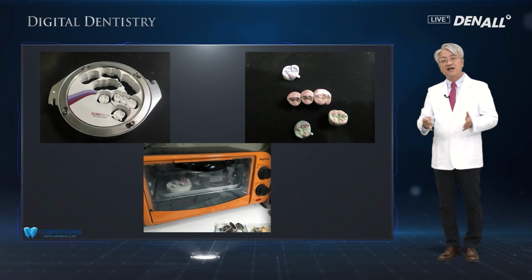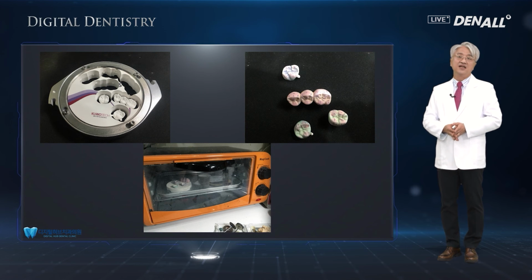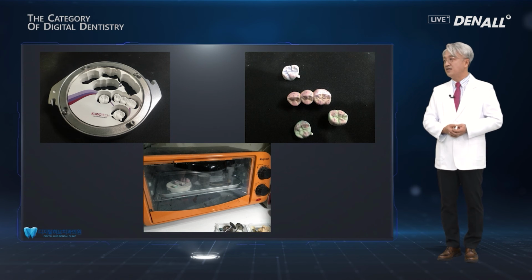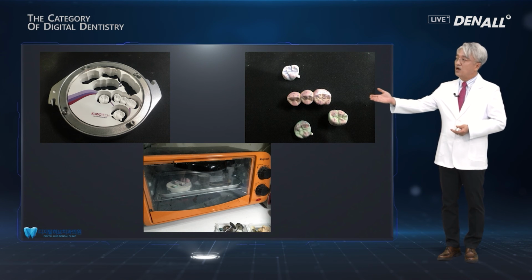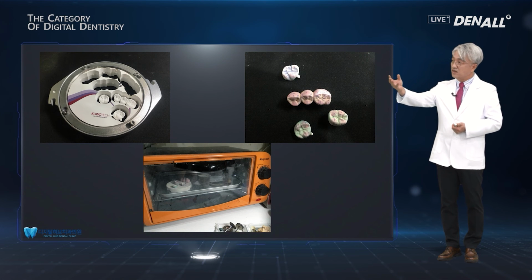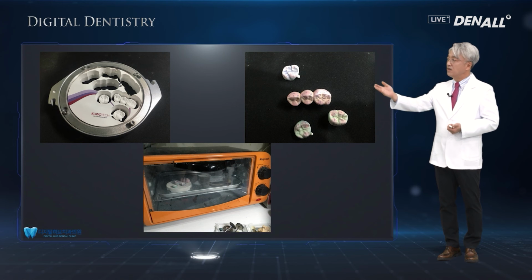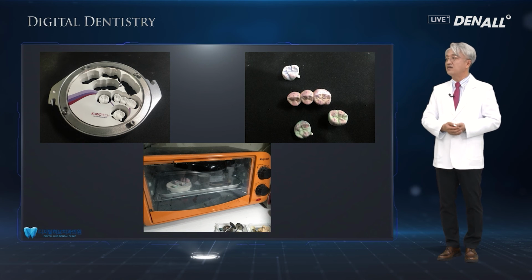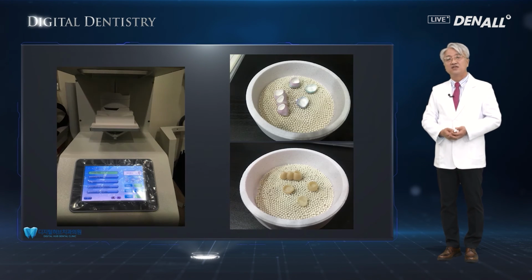And how zirconia is made, let's explain with the color blocks. Like this, using CAD/CAM, a zirconia teeth bridge was made, colored and then sintered, and the final prosthesis will be made. Now on the left top, you have the zirconia block. In the milling machine, the teeth are cut, and this is how it becomes available. The crowns are divided, and you can see here it's colored to look very close to your teeth, and then it's dried for 7 to 8 or 10 to 12 hours.